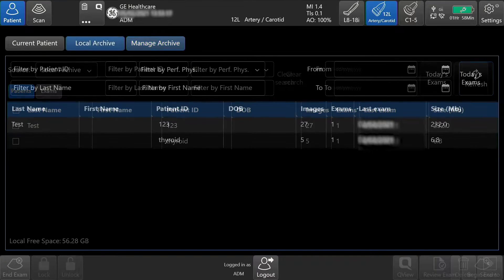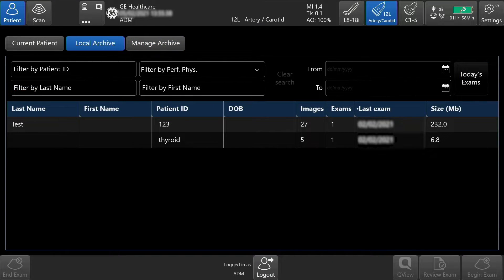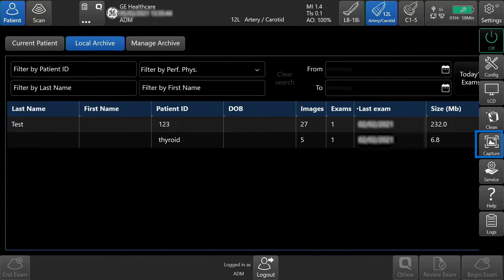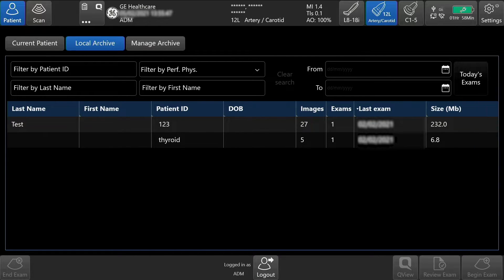To capture a single screenshot, tap Settings located on the top right-hand side of the touch screen, then tap Capture. The screenshot is saved and will then be saved to the USB.